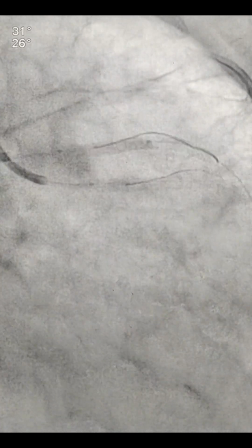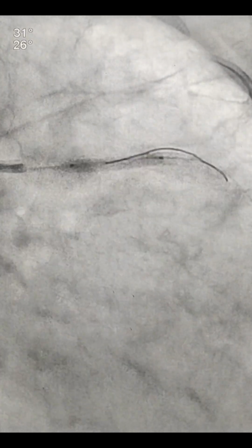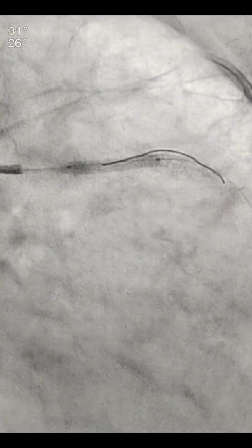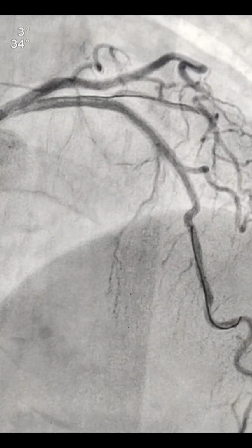So we kept that overlapping segment just below this diagonal opening, because we didn't want the diagonal to get pinched. Already a wire is there in the diagonal, so this wire got jailed after this stent deployment. And this was the overlapping of the stent with the same balloon. And this is the scene after deployment. There was no pinching of the diagonal.